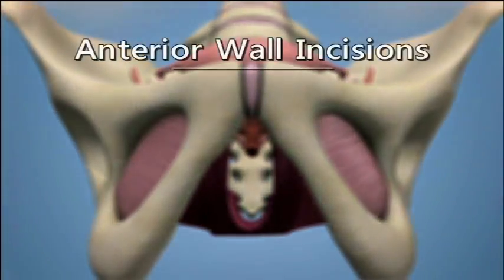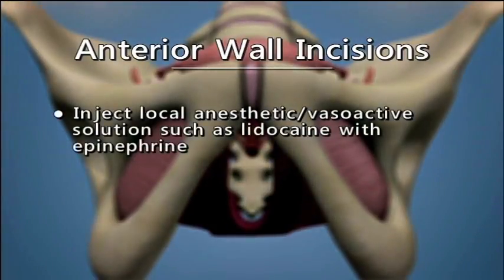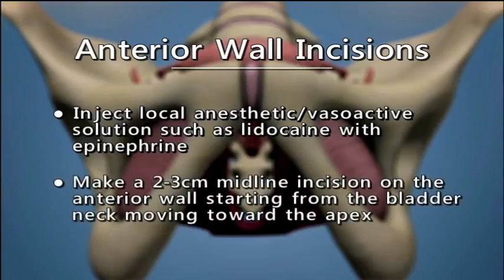Anterior Wall Incision. Inject a local anesthetic vasoactive solution such as lidocaine with epinephrine. Make a 2-3 cm midline incision on the anterior wall starting from the bladder neck and moving toward the apex.